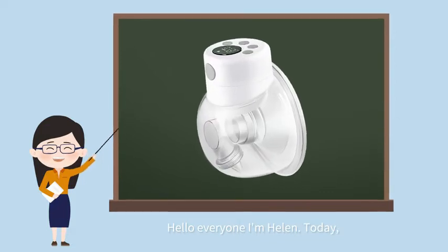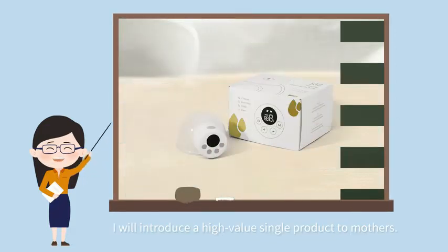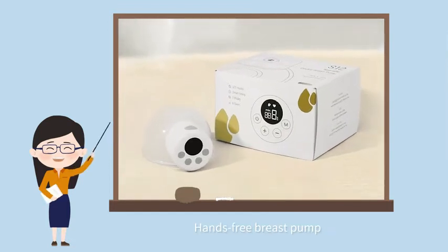Hello everyone, I am Helen. Today, I will introduce a high value single product to mothers: a hands-free breast pump.